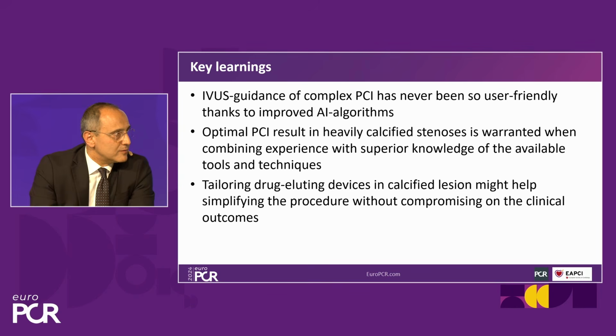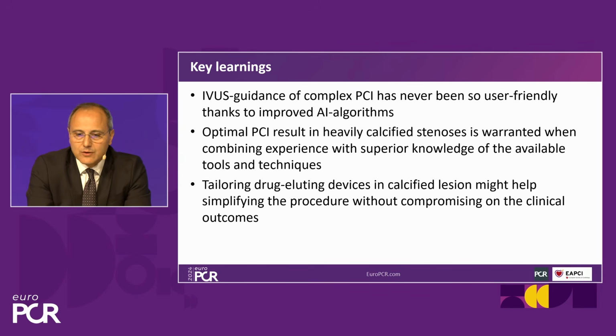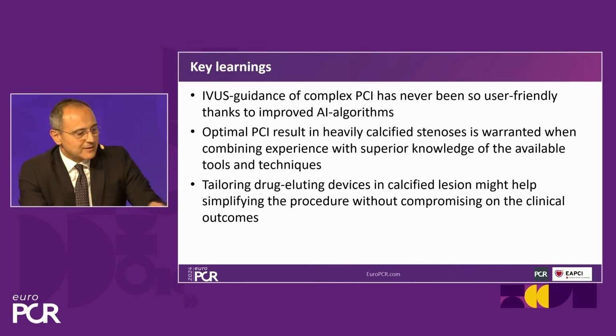And I take the point from Robert that we need to produce more data, but for the time being, perhaps we can start thinking of this hybrid approach with drug-eluting stent and drug-eluting balloons in the setting of calcified lesion.